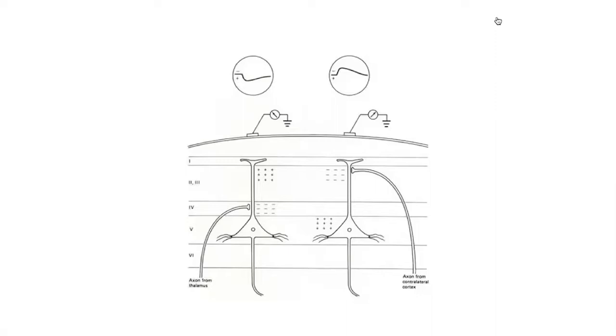The other part of this slide that's important, but also could be misleading, is that we're not sampling the electrical field at one spot and then sampling the electrical field at another spot. You can see 2 spots being sampled here from 2 different neurons. But these samples are really electrical field. And you might remember from high school that if you take an electrical field at one location and compare it to another electrical field, you get a potential difference. Potential at 2 locations can differ. And when you have a potential difference, that is a voltage. And that's the output of the EEG.